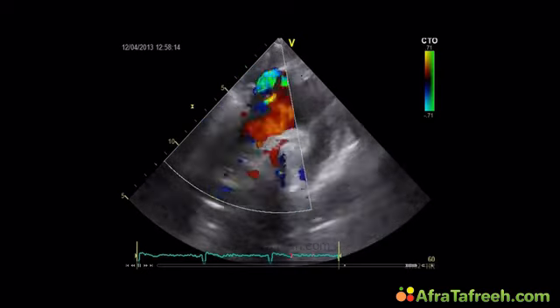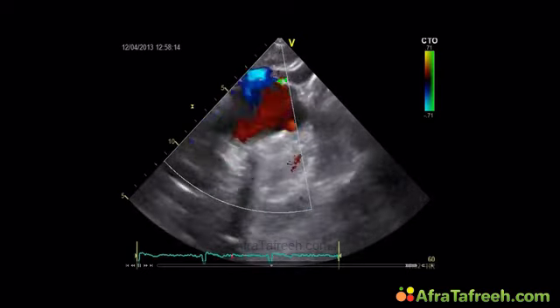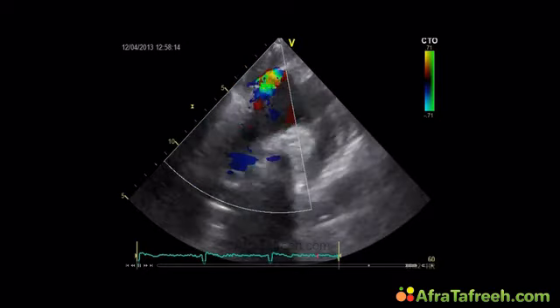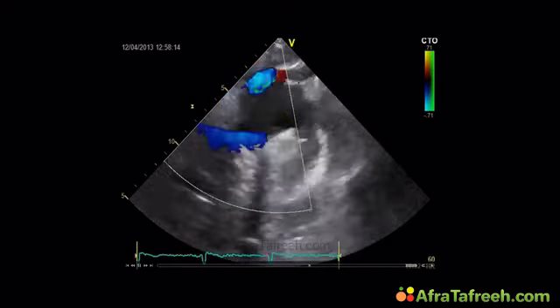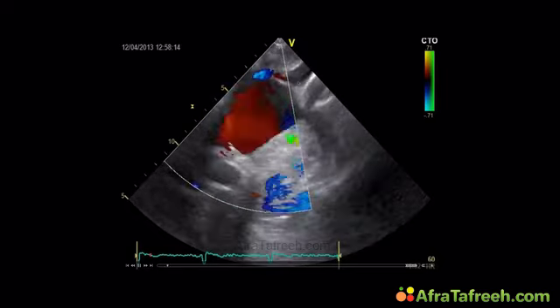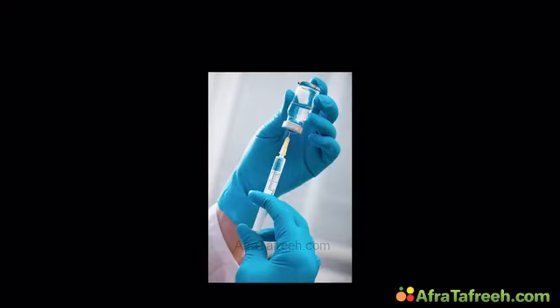And there's kind of a structure right here, or a vessel, maybe, and then there's kind of a membrane. So what you can do is you can simply do the following. You can inject contrast, okay? And this is just what we did. We took normal contrast. Now, we don't necessarily need to give any other contrast than what you would usually give to detect a PFO.